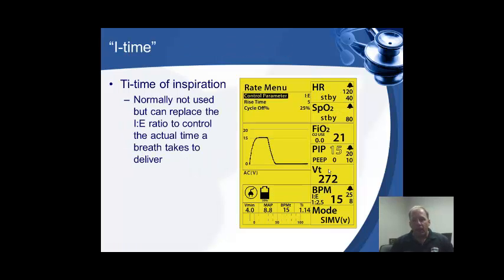All right. Now, if you hold down that breaths per minute button over here, right out to the side here, you get a window that pops up. Remember, your rise time tells you how quickly that patient's getting a breath. And those lower settings, the lower numbers, are whenever the patient's getting a quicker breath. Higher settings when they're getting a little slower breath.